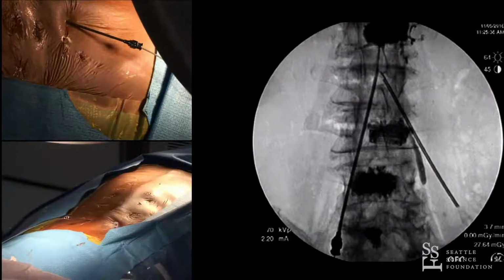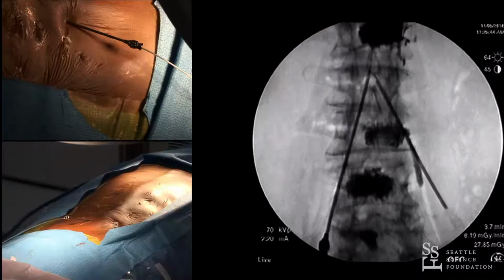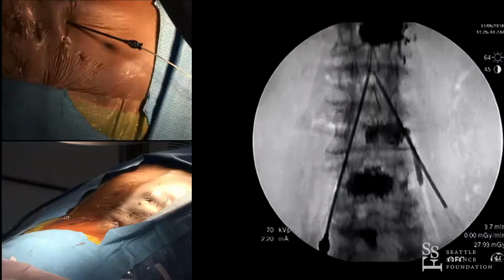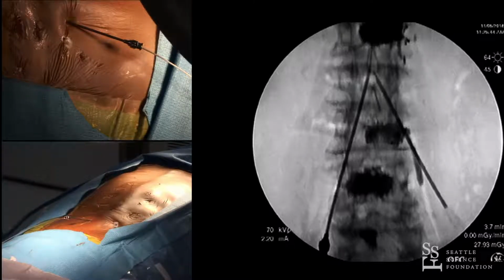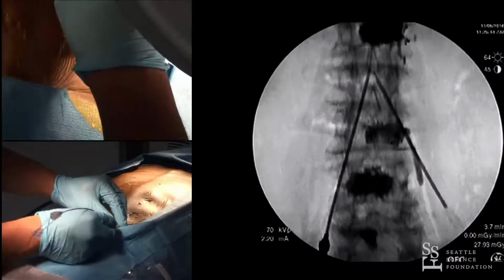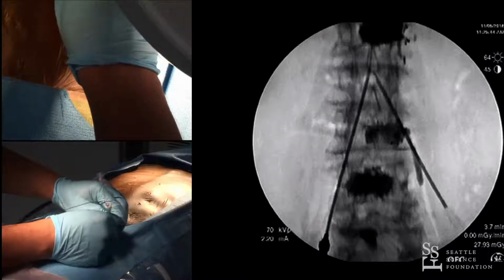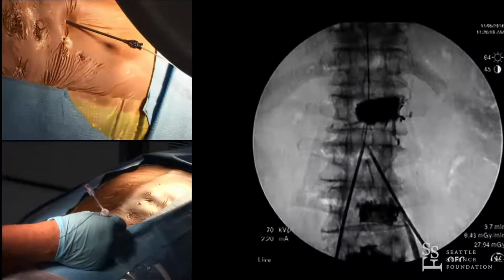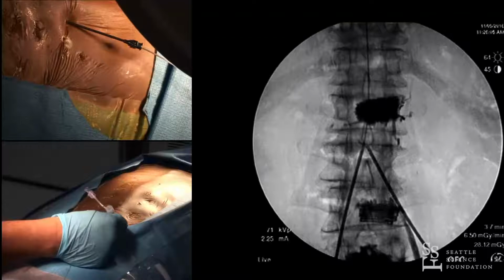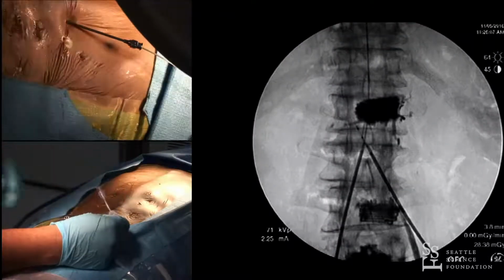And open up the C again. Open. Great. Lock. 2 inches north, please. Right there. There we go. That's no obstructions there as much.